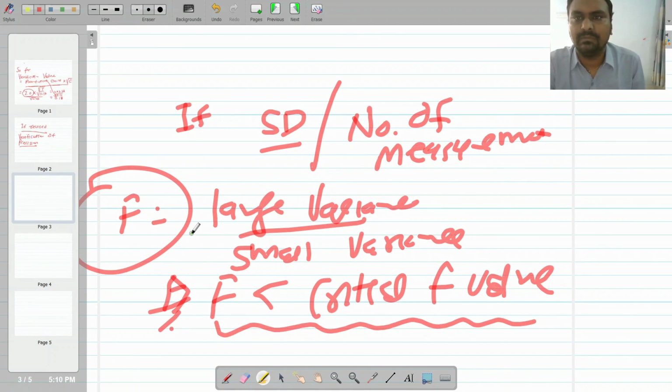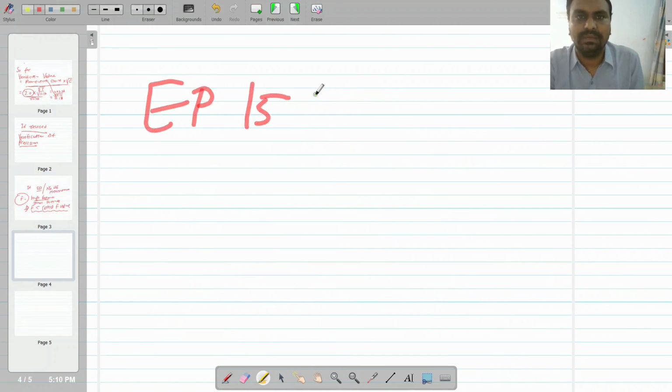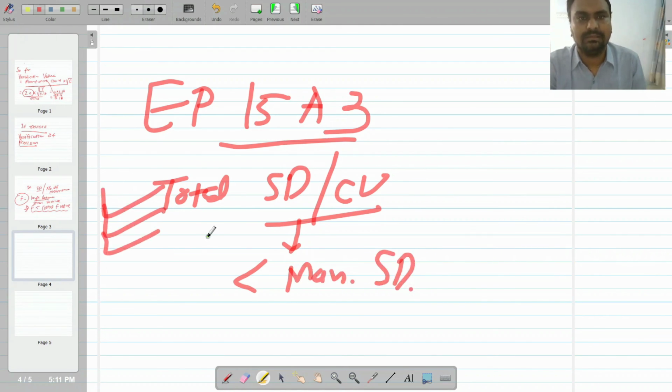But if the number of measurements or SD is not given by the manufacturer, then we can perform the EP15 A3 protocol for precision. If the total SD or CV is less than the manufacturer's SD, then our method is validated in terms of precision.